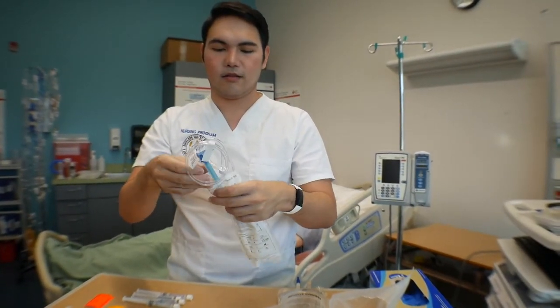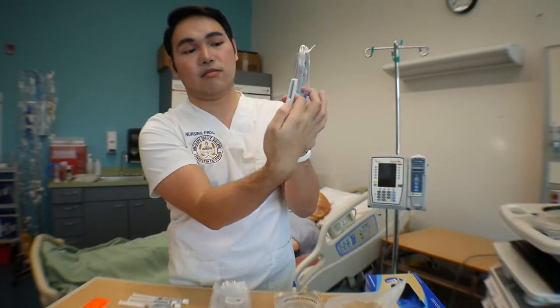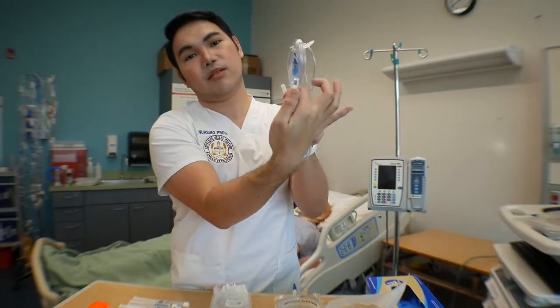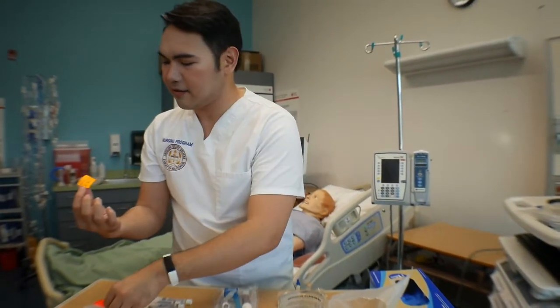Okay, and then make sure you clamp it because they always come unclamped. So just clamp it as soon as you take it off the bag. And since I already have the label for the tubing, might as well put it.